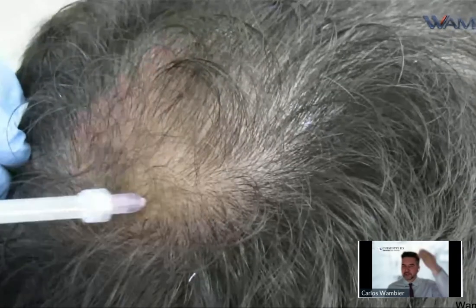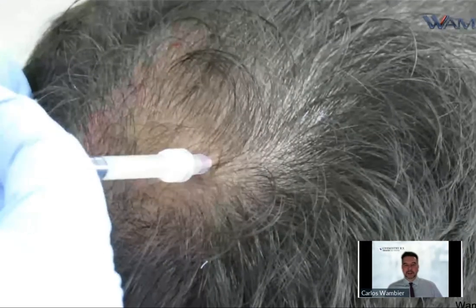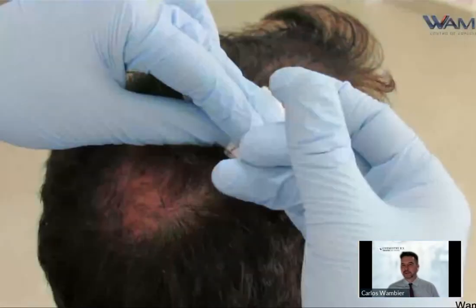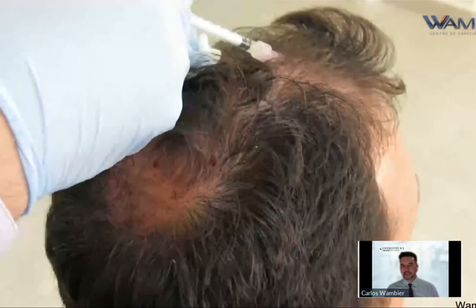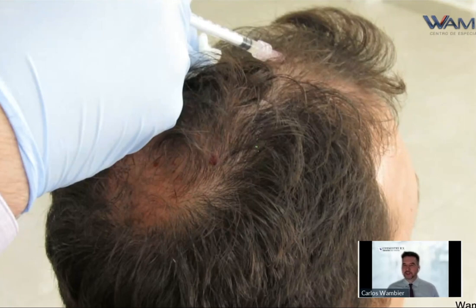I start on the back and move to the front when injecting on the vertex. You see it's really fast when you get the feel of how much to inject — usually 0.05 per centimeter, or one centimeter and a half, one inch. Then you try to inject more where the patient needs more or wants more.